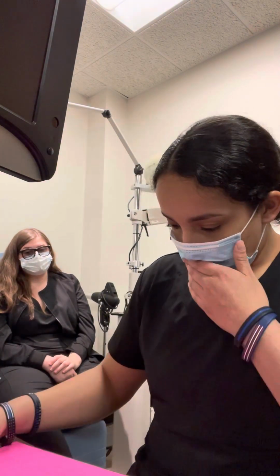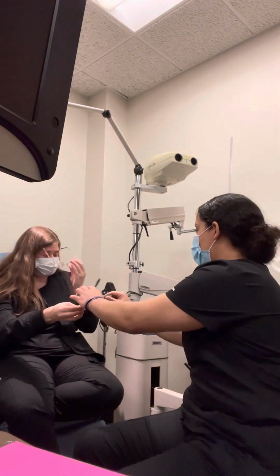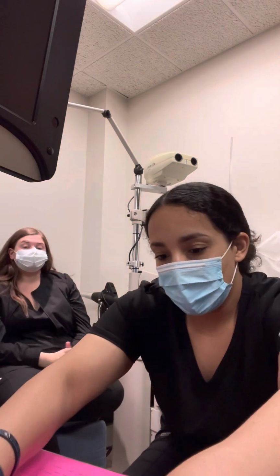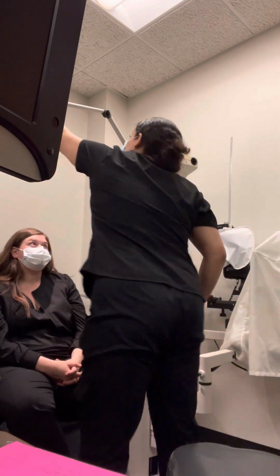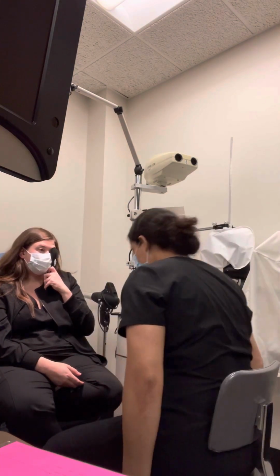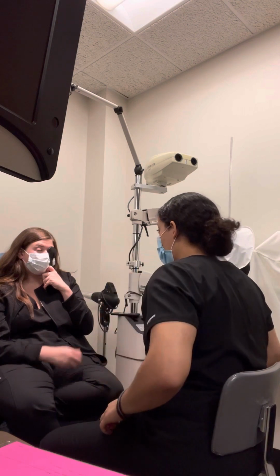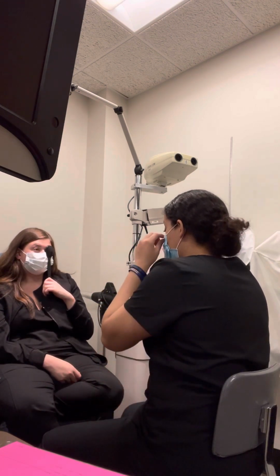Okay. So I can go ahead and take those glasses from you and your actual glasses as well. Okay. Next, what I'm going to be checking is basically how well you see in your peripherals. Go ahead and cover up your left eye for me. Okay. So with your right eye looking at my open eye, I'm going to flash figures of 1, 2, and 4 in 4 different spaces. Just let me know what you see.